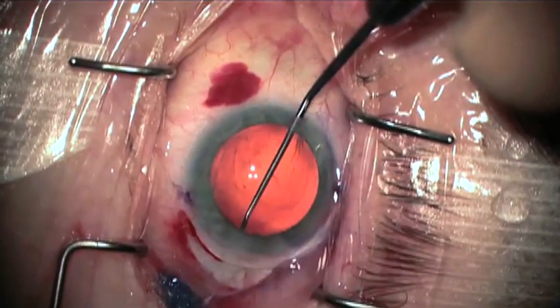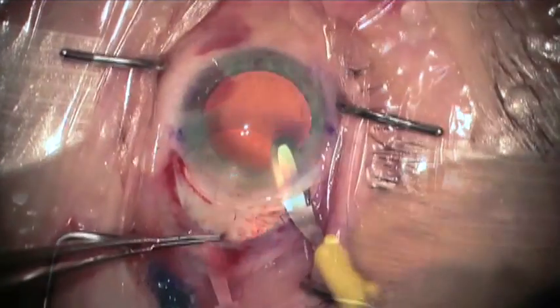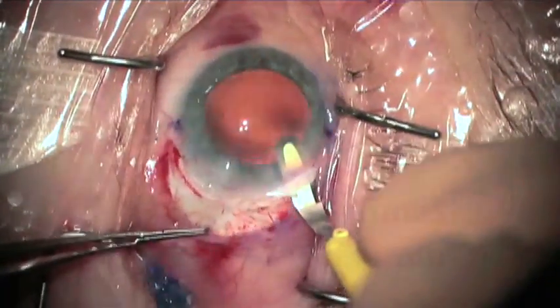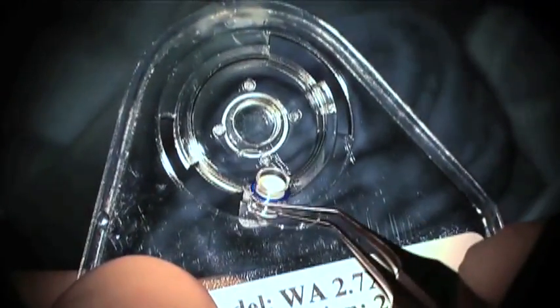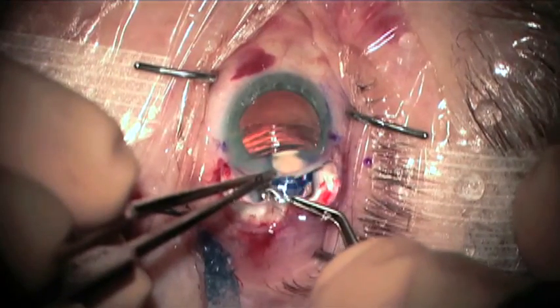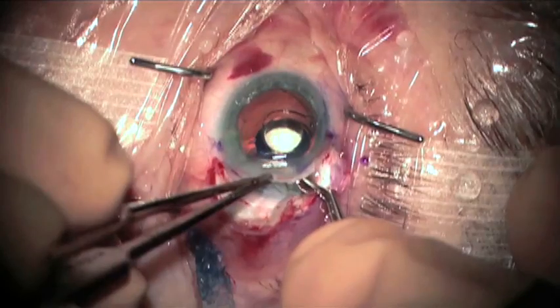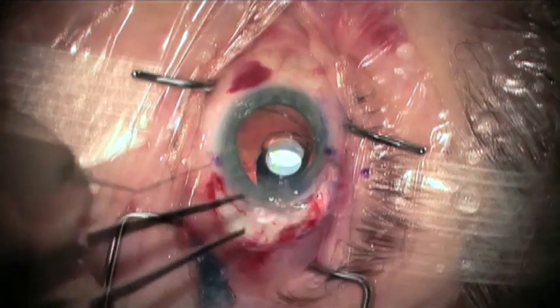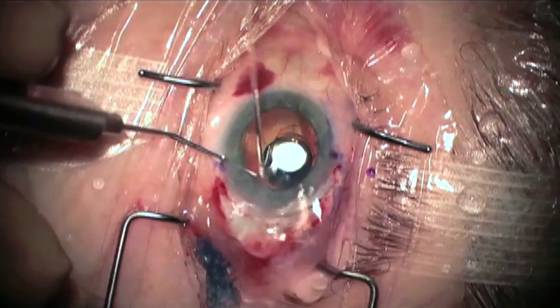Once the capsule has been polished both anteriorly and posteriorly, the incision is enlarged internally with the crescent blade to include 11 millimeters, and the telescope device is inspected. It is grasped not on the telescopic elements but only on the plate, and then under copious viscoelastic, it is angled at approximately 35 degrees and implanted with the leading loop into the capsule bag in one movement.